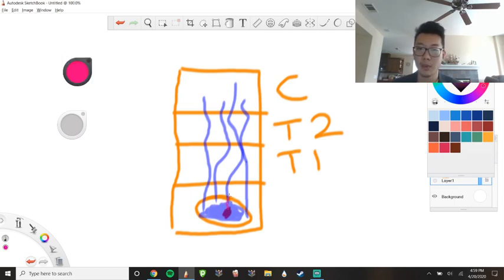As our blood moves into here, scientists put some of those virus pieces over here. So when these two things mix, it's actually just going to change colors. We'll do purple. Oh, I changed colors. So if it changed colors, that means, uh-oh, you're probably positive.